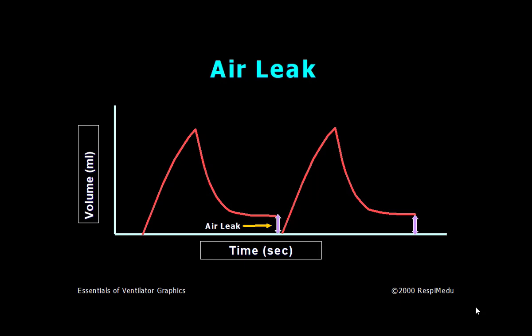Air leak, what goes in, all of it does not come out. Some of it is lost. So the volume does not reach the baseline. So this is air leak.